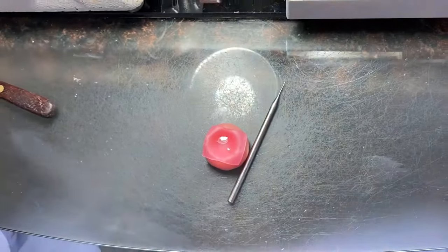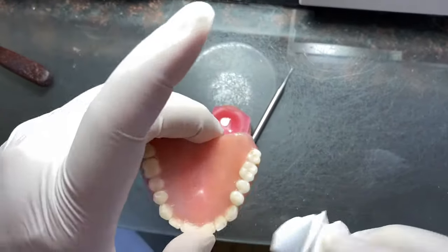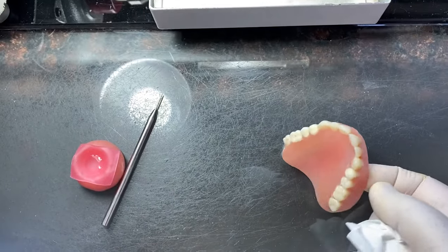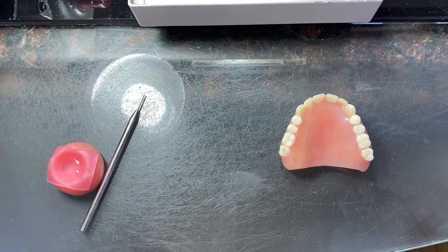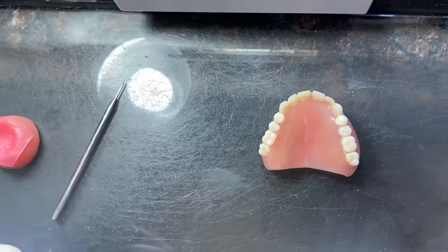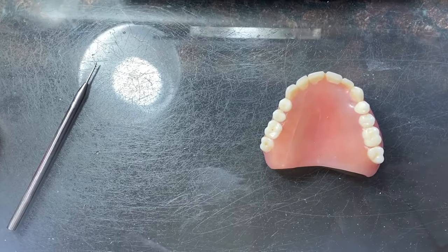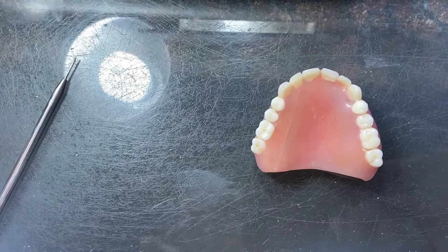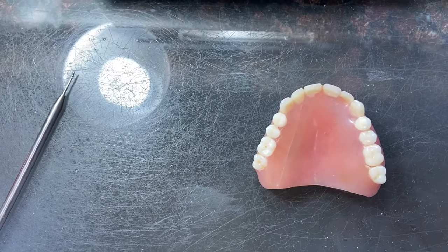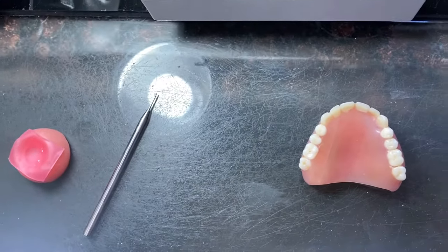This is about done. You clean the extra things in there. Leave it for one or two minutes. After that, you can use it for a while. Then you can take it to the lab or dentist to fix it. You tell them you glued it with this — perfect glue — then they make it perfect for you. That's it. Thank you.